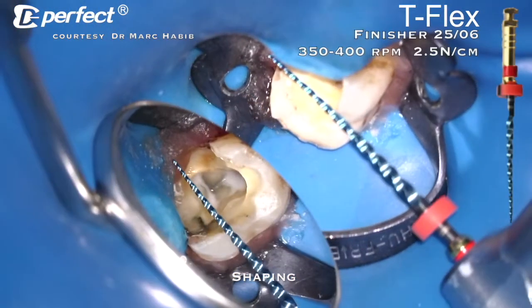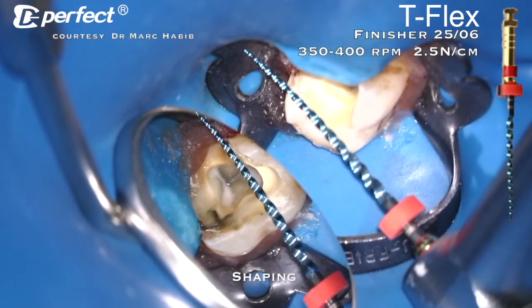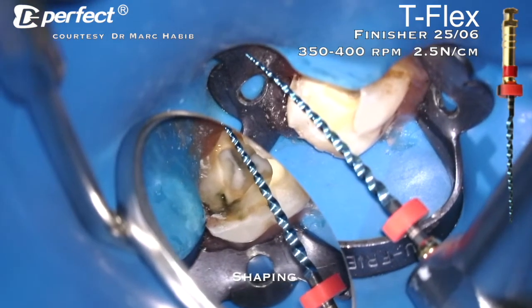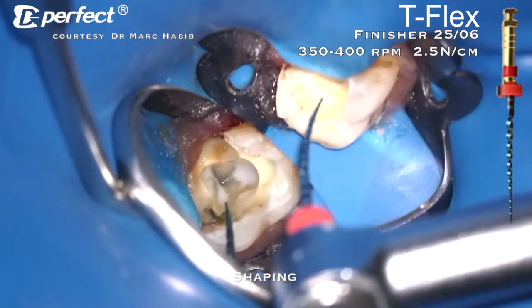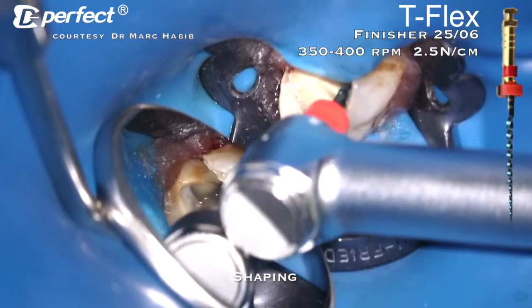And then we move to a bigger file, the last one of the Finishers in the T-Flex system, the 25 tip and 6% taper. This is the standard 25 with 6% taper. Of course, you do have work to do in the distal canal.